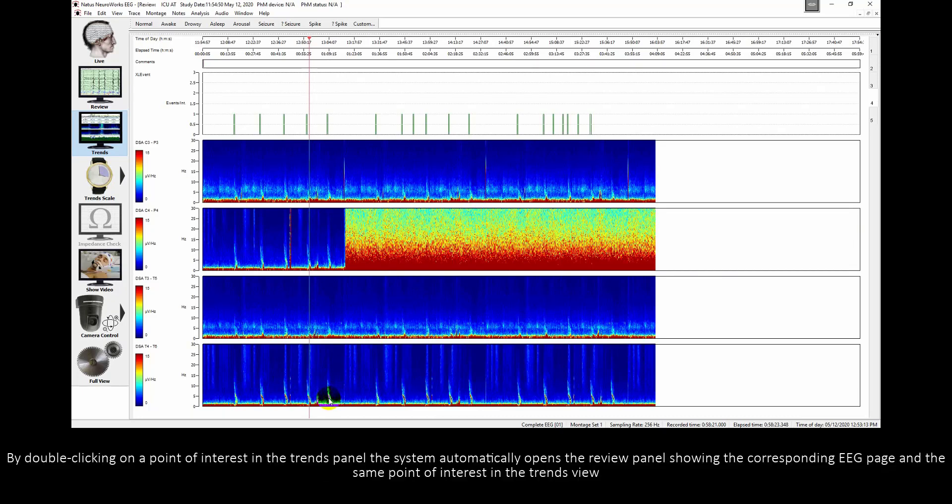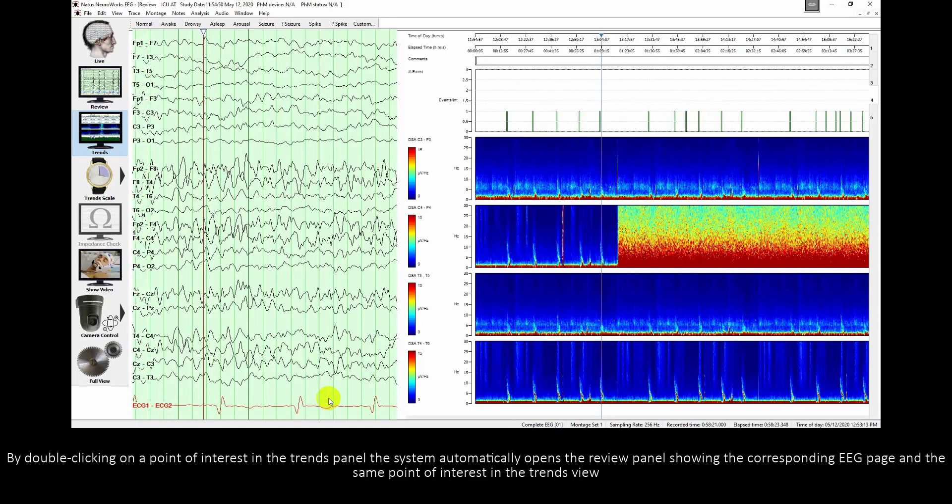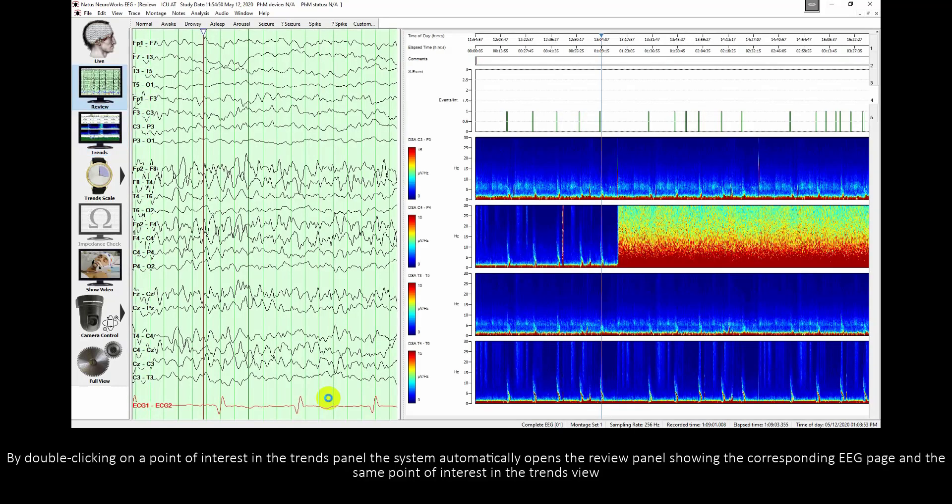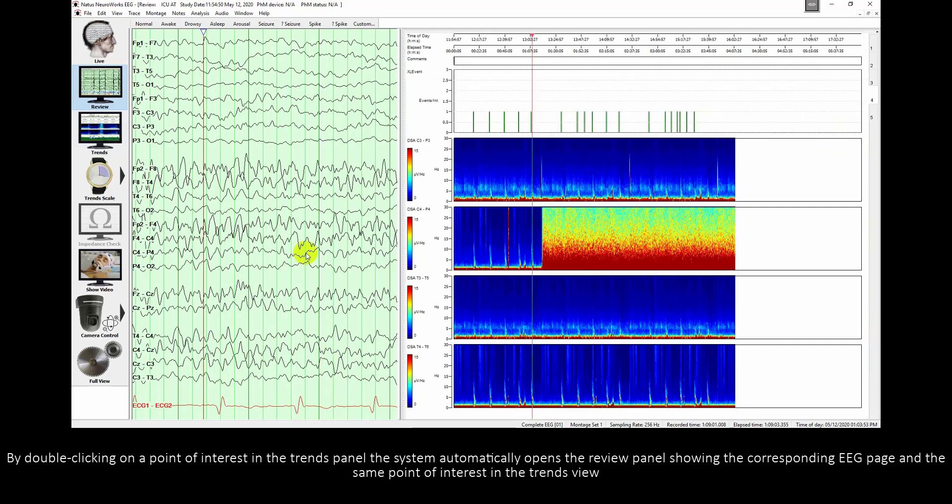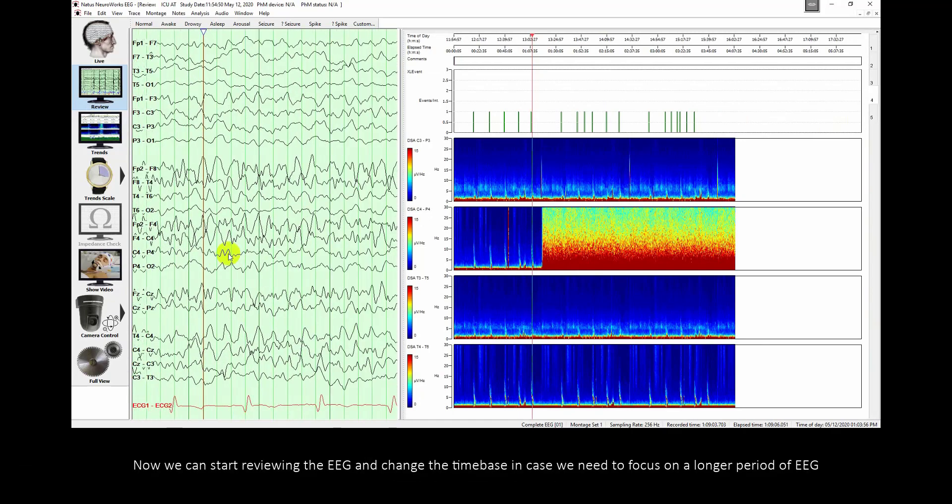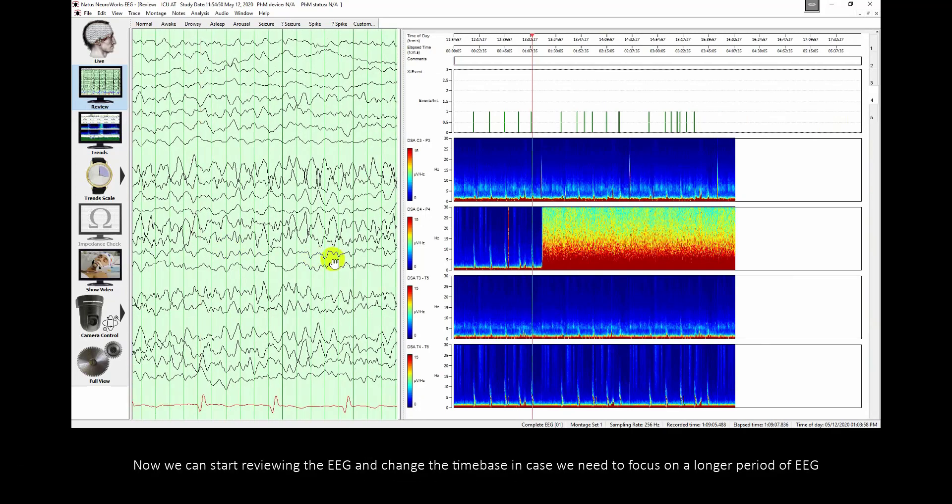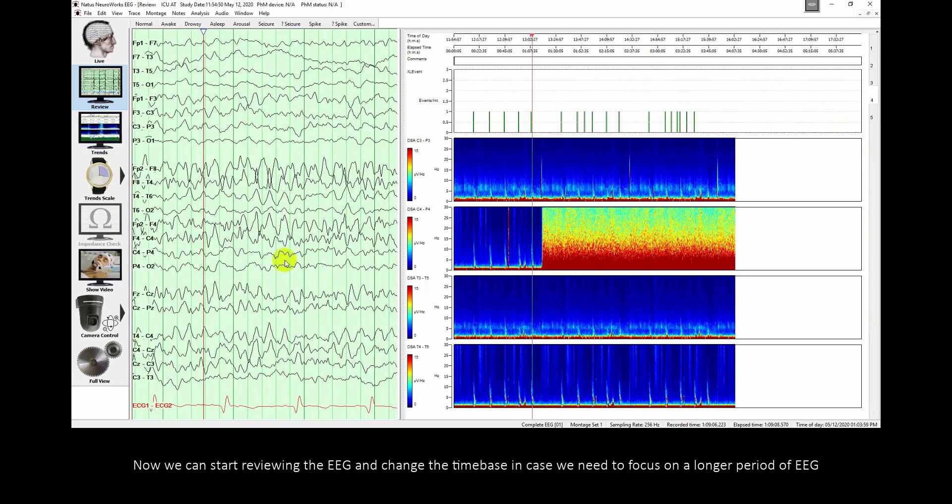By double clicking on point of interest in the trends panel, the system automatically opens the review panel showing the corresponding EEG page and the same point of interest in the trends view. Now we can start reviewing the EEG and change the time base in case we need to focus on a longer period of EEG.